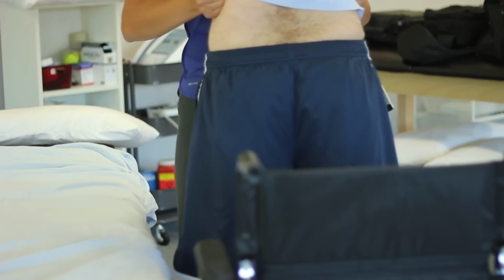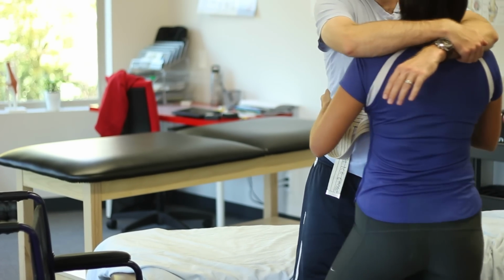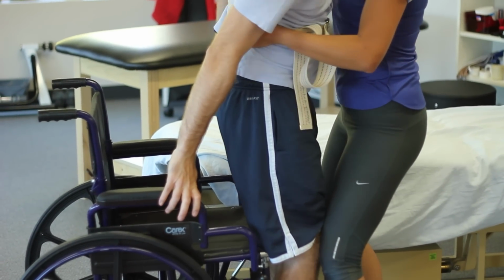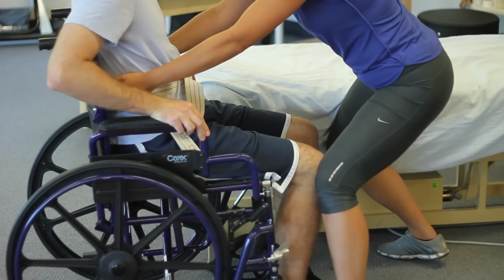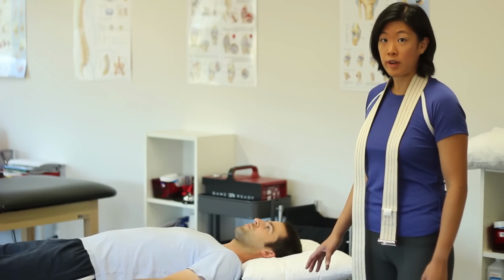Cue them to use their hands and their arms so that they can brace themselves in case of a fall. The best surfaces for their hands to land on are the arms of the wheelchair. Slowly lower them down. You don't want them to rock backwards or else the wheelchair will tip backwards. Make sure you always place your knees against their knees so that if their knees do buckle, you can brace them very quickly.